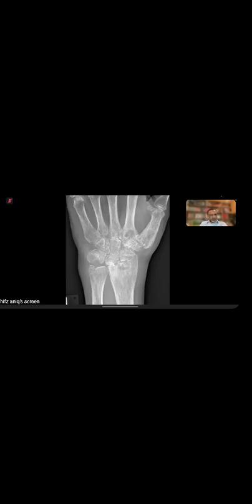But we forget about gout because it is such a mimicker that it can basically throw you off sometimes, and you always think, oh, what is this? And then sometimes you hold your head: why didn't I think of that earlier? So this was one of those cases which we struggled with, and in the end, of course, we reached it. But there's one clue we did not think of at that time. We'll come back to that in a minute.